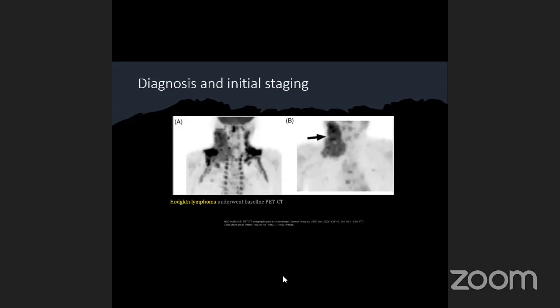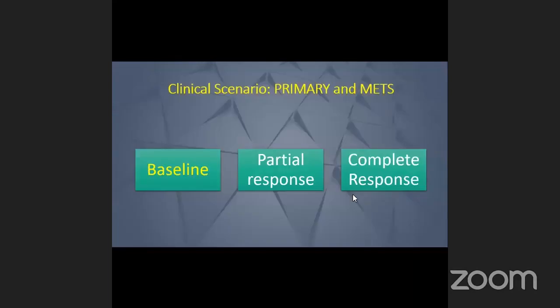And usually, especially in the winter, those who have brown fat, it keeps them warm. So if the patient comes in for the PET scan, we usually advise him to rest, because you can see that this brown fat is working here, and there is some confusion. Is it lymphadenopathy or brown fat? But after they take a late image, they agree that this is lymphadenopathy in this case.